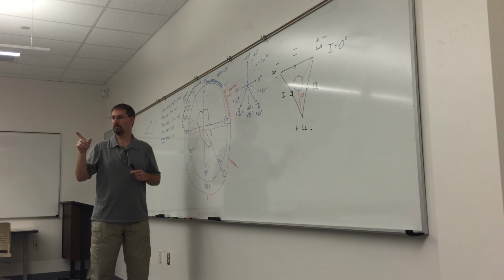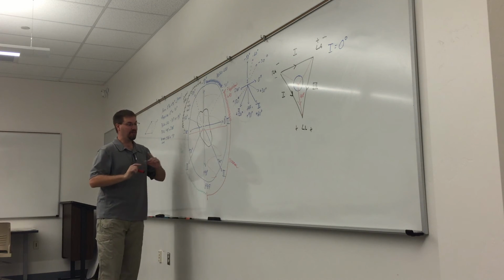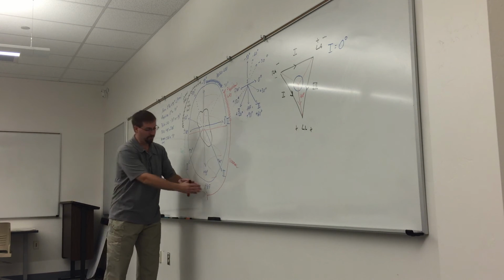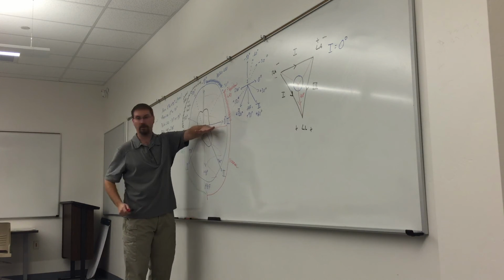Okay. Well, can you say it one more time? What's confusing is that... all right, let's go through it one more time. So, lead AVF. You guys found it on your 12 lead? Yes. You found it here. I'm going to draw a line perpendicular to AVF. That's this red line that I drew here, okay?